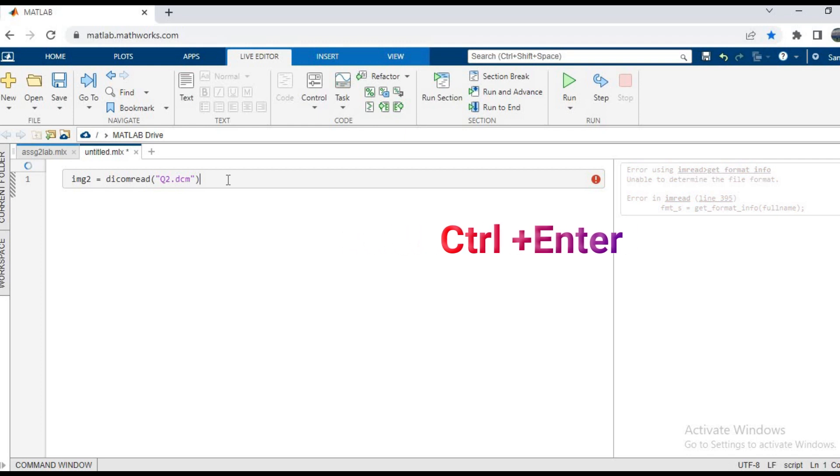So as you can see, the img2 variable has now been created and it is a matrix which is 432 by 432. That is the size of the matrix that you can see. So going forward, now we have to show that this image has been opened or not.